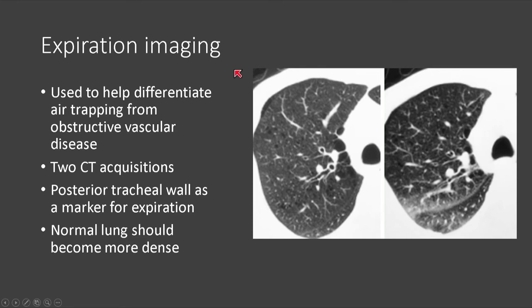Once we have expiration imaging, we look for expected signs. Focusing on the trachea: during inspiration the posterior wall bows outward (convex outward); during expiration it should bow inward. Looking at the lung parenchyma, normal lung should go from more lucent on inspiration to more dense on expiration as air is blown out — the lung becomes less air-filled and more atelectatic, developing areas that look like ground glass opacity, but this is simply normally airless lung.